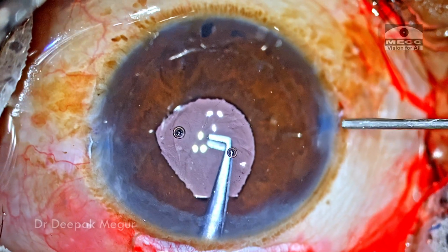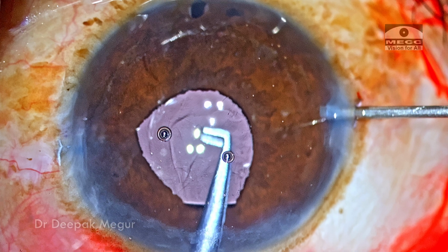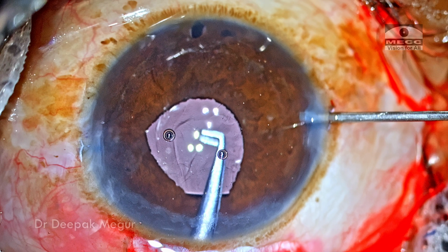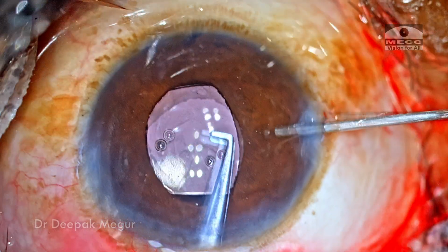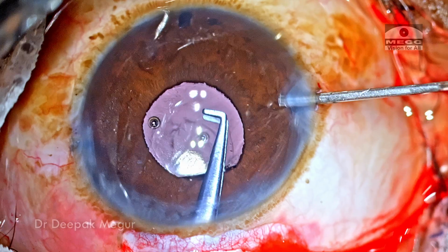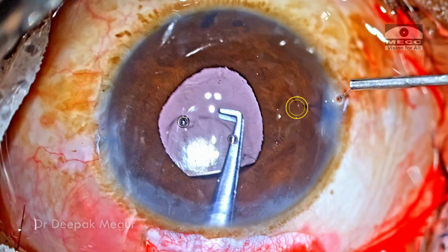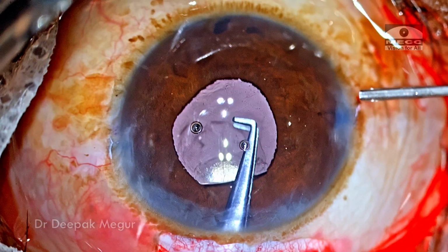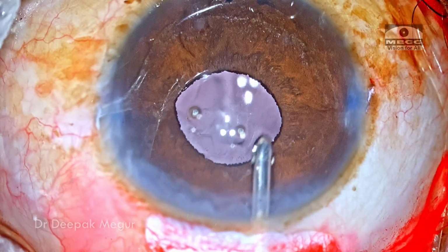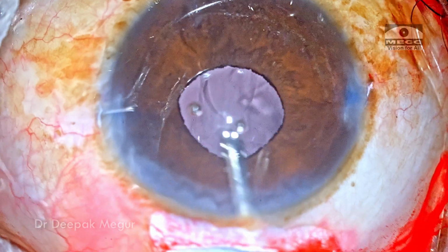It's ideal to enclave in the peripheral part of the iris. If you can enclave in the peripheral part of the iris, the amount of pupil distortion is minimized. Again, the iris is nudged into the claw. I prefer to do it one more time, so 2 times, and the lens looks to be very well enclaved and stable. So far the pupil appears to be round, so cosmetically it appears quite good.